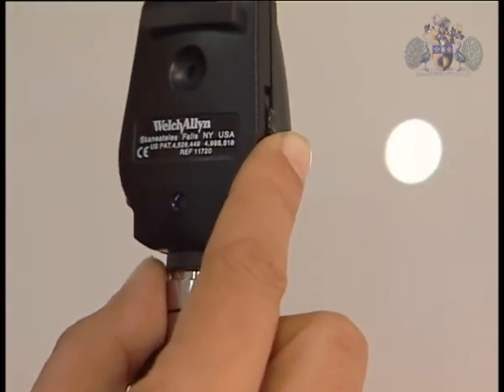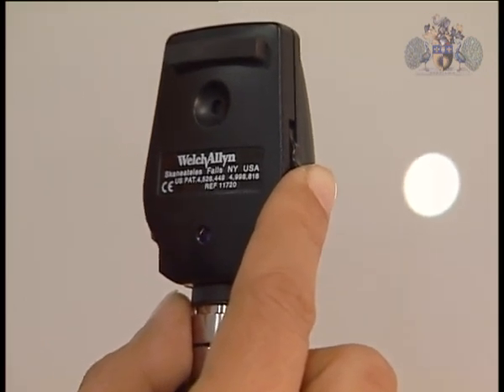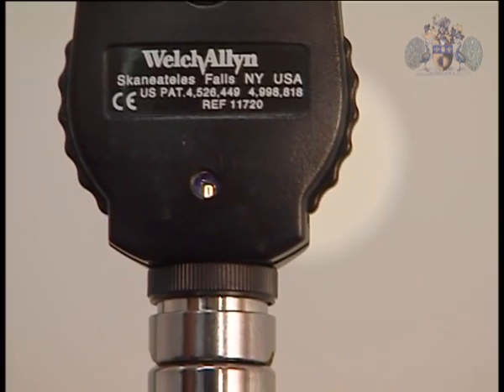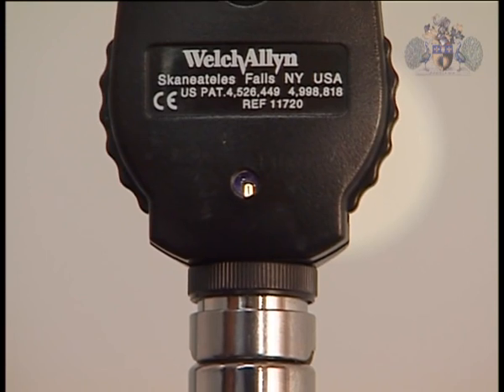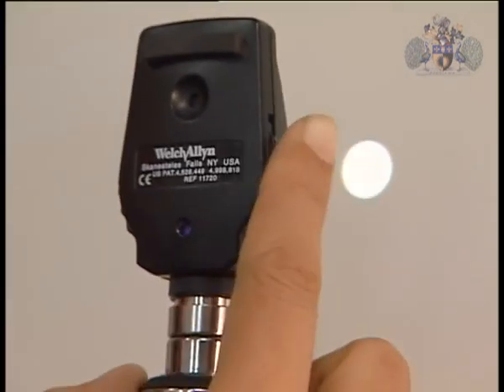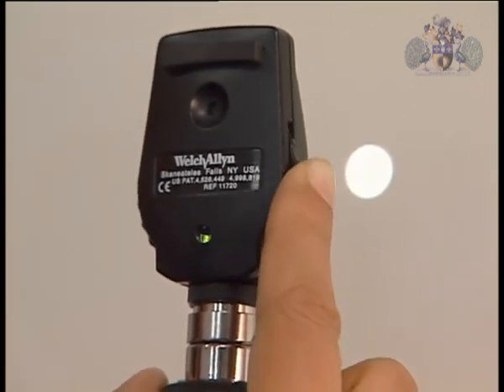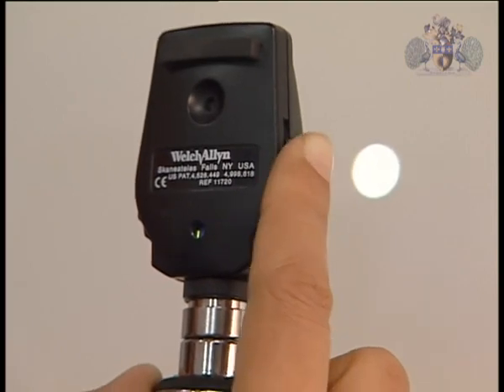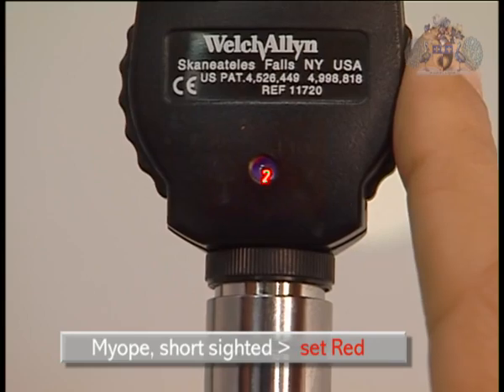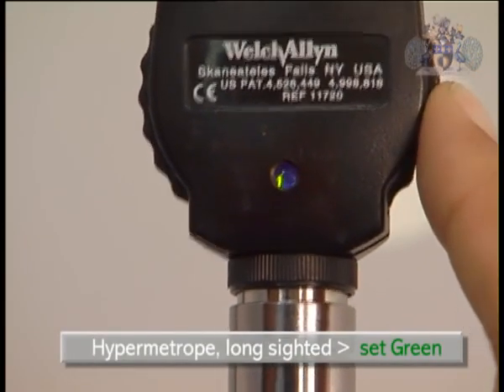If you do not wear glasses, if you're going to keep your glasses on, or if you have contact lenses in, you want to set the number here at a white 0. If you have a refractive error and you know what it is, you will need to adjust the lens power in the ophthalmoscope to correct for your refraction. If you're a myope, you will set it to a red number. If you're a hypermetrope, you will set it to a green number.